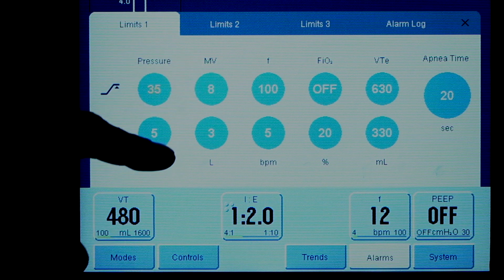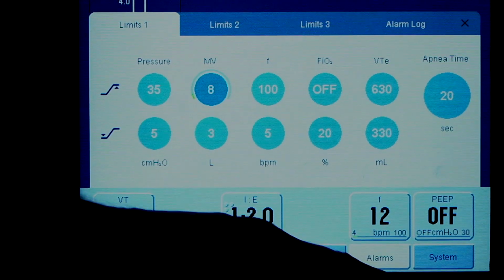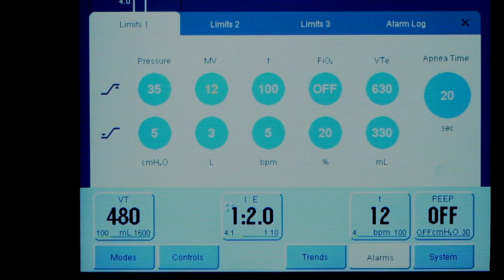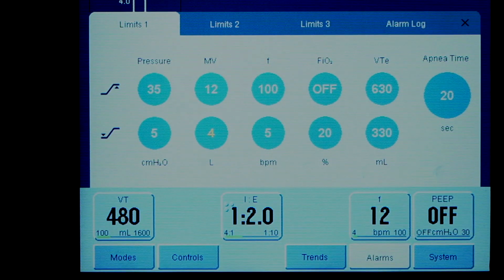Next thing is the minute volume. You'll see that this defaults to a high of 8 and a low of 3. This is partially set by the ideal body weight that you've entered when you initially set the patient setup, but these are pretty reasonable, although we'd recommend in the majority of intensive care patients a high of around 12 and a low of around 4, simply because we'll be ventilating at a higher minute volume than many anaesthetics.